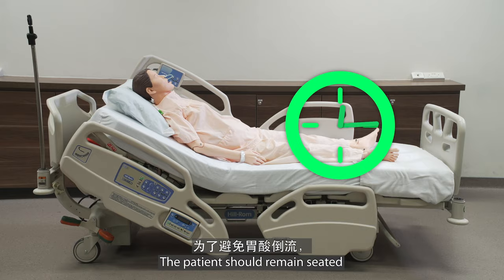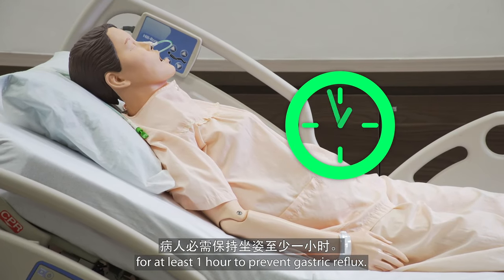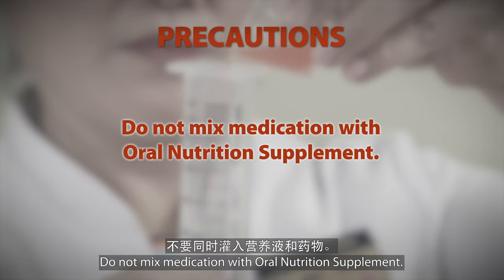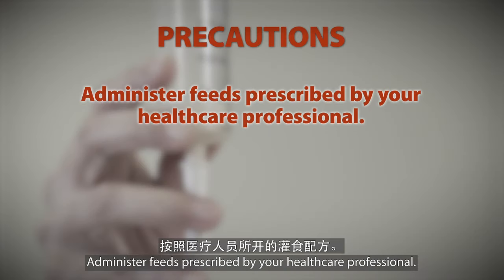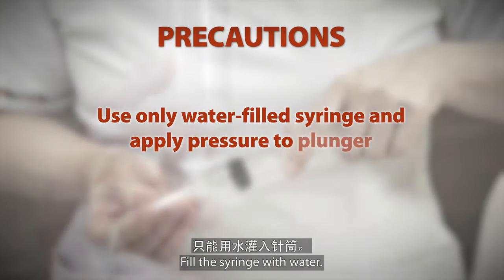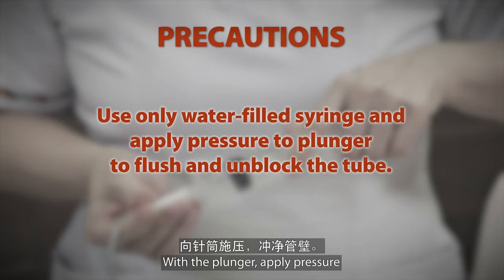The patient should remain seated for at least one hour to prevent gastric reflux. Do not mix medication with oral nutrition supplement. Administer feeds as prescribed by your healthcare professional. Consult your nutrition nurse specialist on other options that do not cause tube blockage. To unblock the tube, fill the syringe with water and use the plunger to apply pressure and flush the tube.